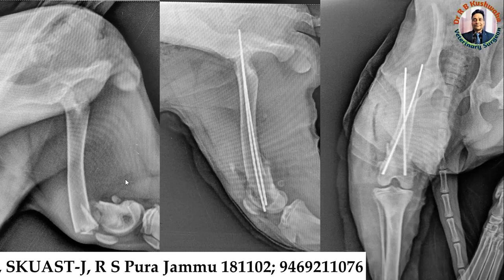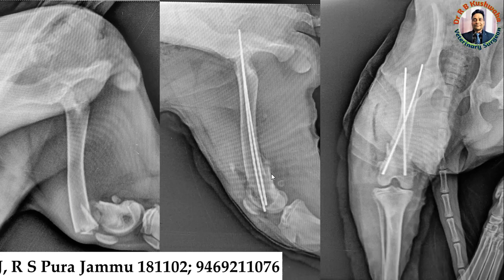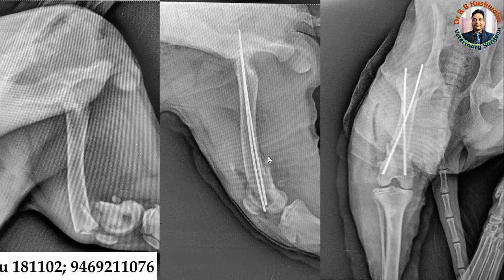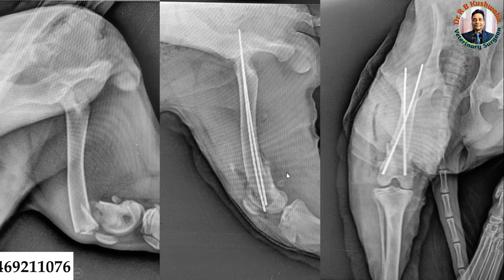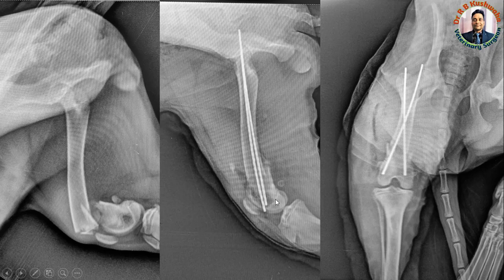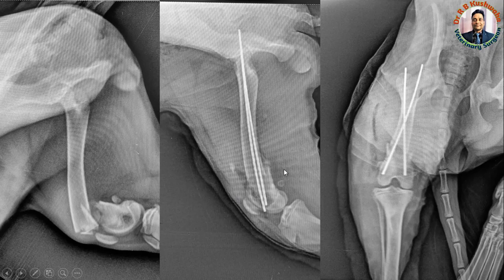This is the medial-lateral view immediately after dynamic cross pinning. You can see how beautifully the distal segment is aligned with the proximal fracture fragment, and you can see the crossing of the pins. This is the medial-lateral view, so it is difficult to appreciate the crossing of both K-wires, but the stabilization and reduction achieved is very good.